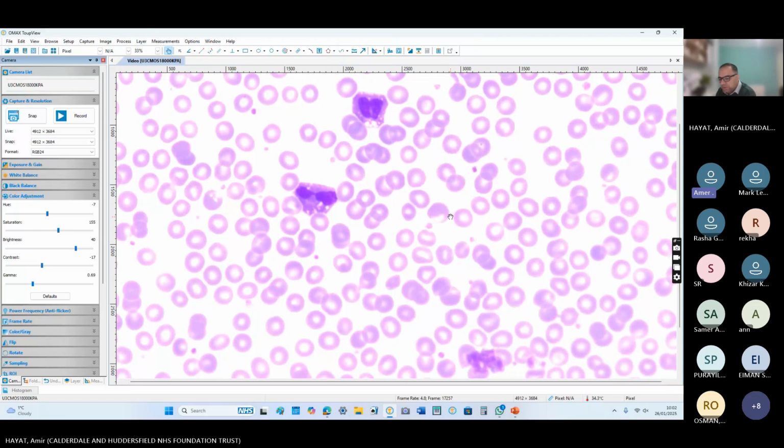So before winding up this case, anyone can report this blood film for example. This blood film is showing prominent eosinophilia with bilobed eosinophils and eosinophil precursors as well. The red cells are normocytic normochromic, and the platelets are normal in morphology. Is there a dimorphic picture, like some normocytic and a few hypochromic? There is a bit of hypochromia, and that's it.